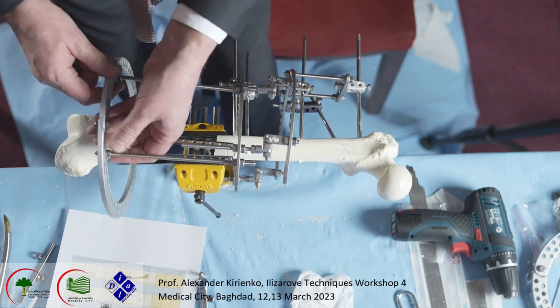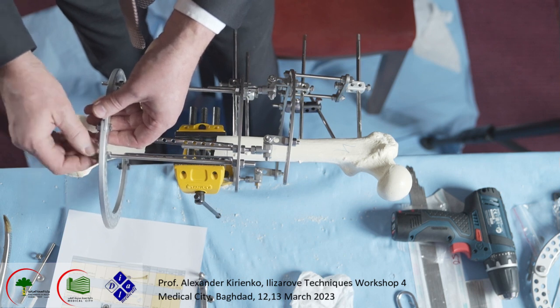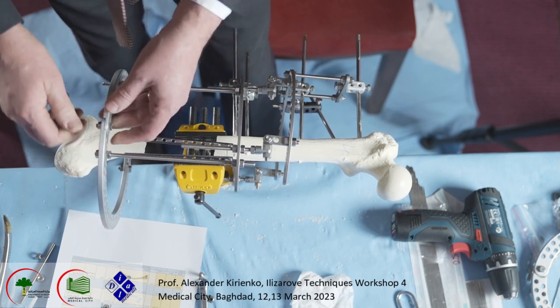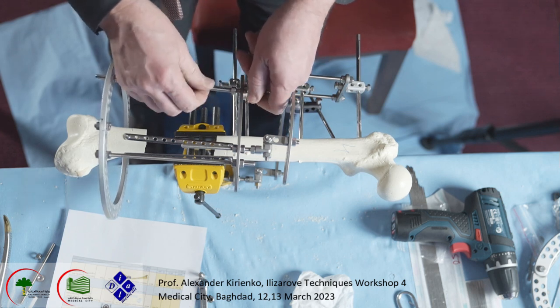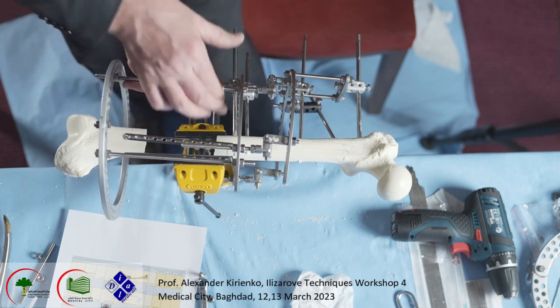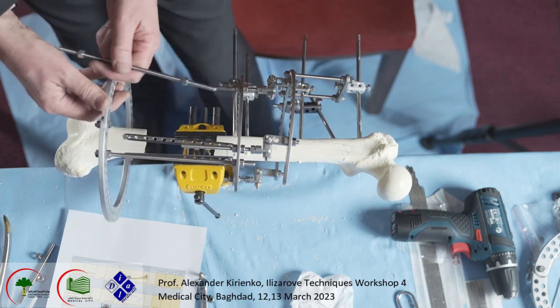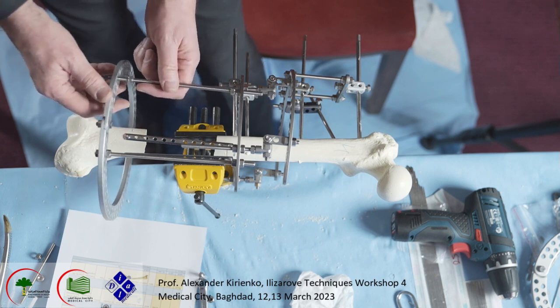If I put this internal, I should put internal here, and the same way here. If I put it as external line for their holes, I should maintain external line. Okay.